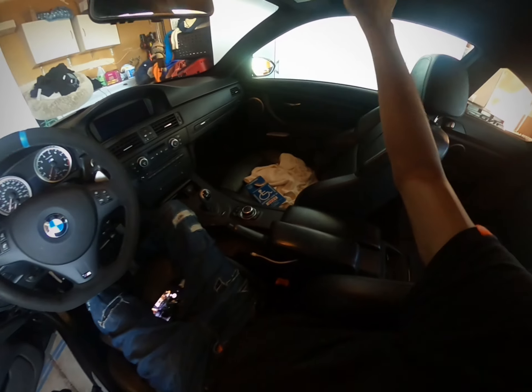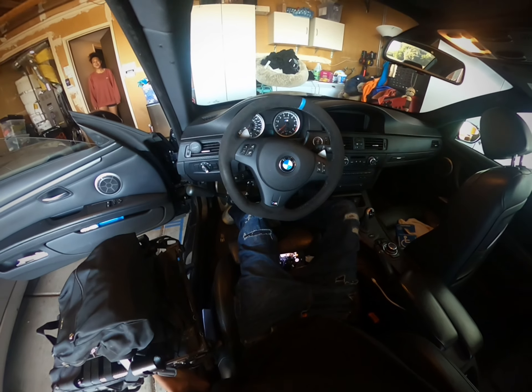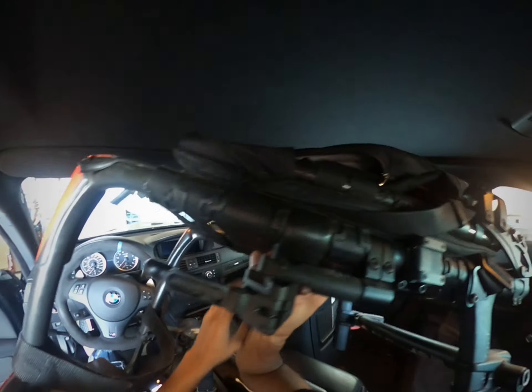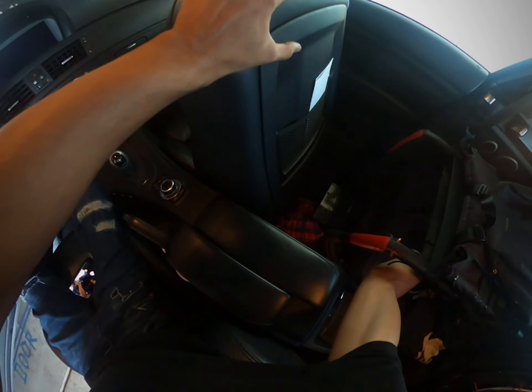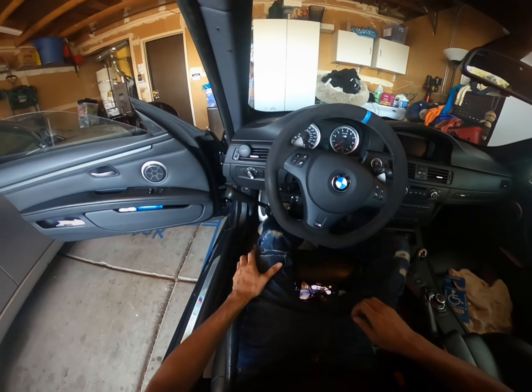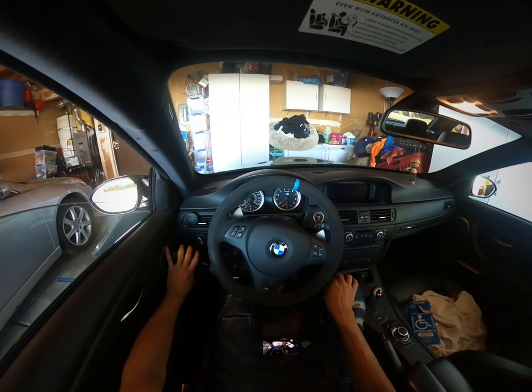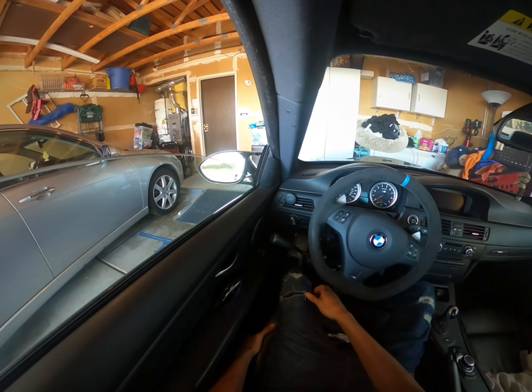I've got to put my chair down to get the wheelchair in. There we go, the wheelchair is in and everything is secure. I always make sure that my foot is on the kick plate.